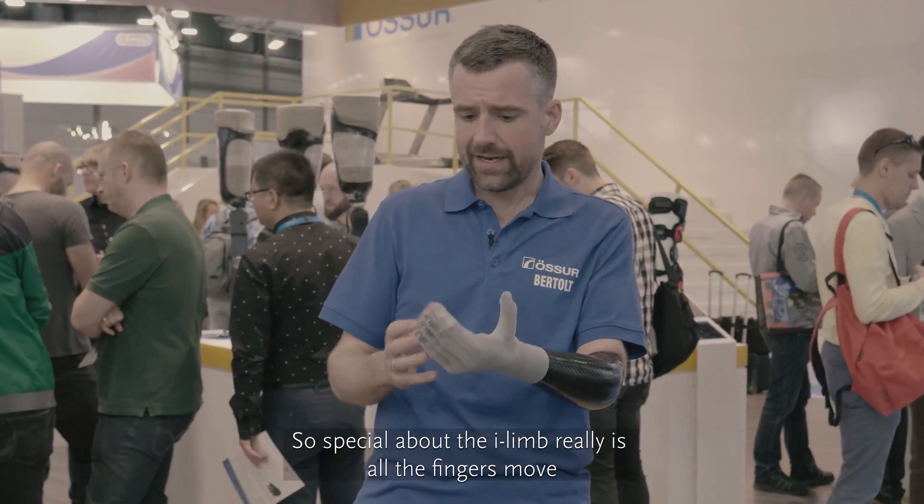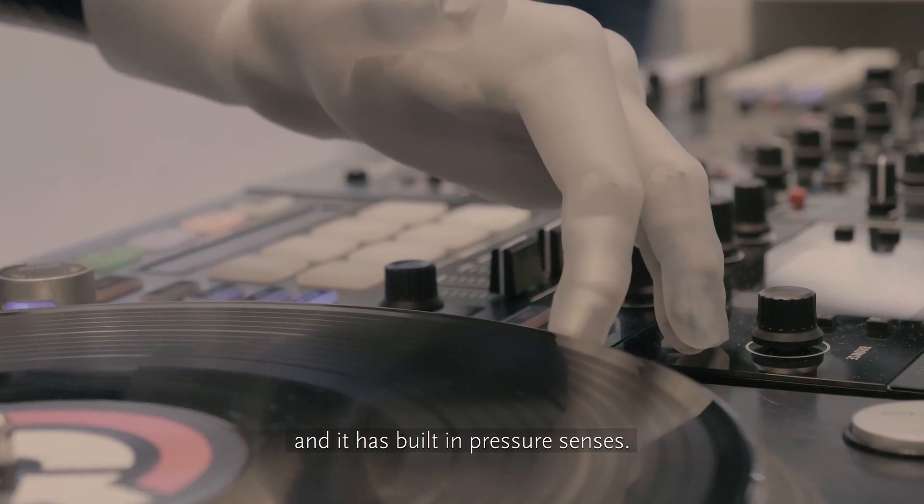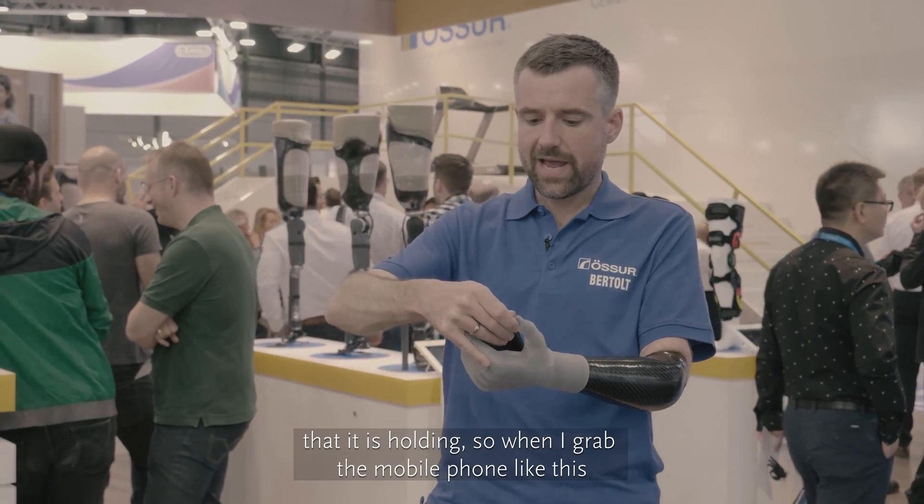What's so special about the i-limb really is that all the fingers move and it has built-in pressure sensors, which allows the hand to understand the shape of the object that it's holding.